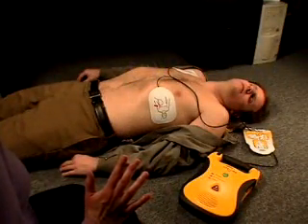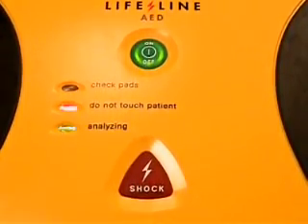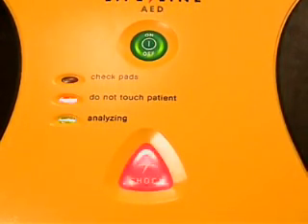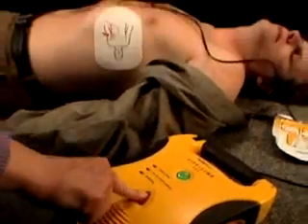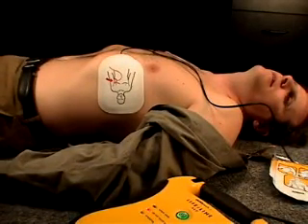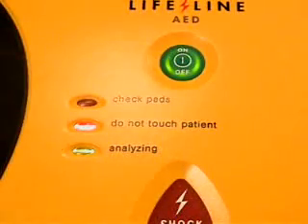Shock advised. Charging. Stand clear. If a shock is required, once the AED has fully charged, the shock button will flash and the AED will instruct you to press the shock button. Press the shock button to deliver a shock. Shock one delivered. Analyzing heart rhythm — do not touch the patient. Once a shock is delivered, the Lifeline AED will automatically reanalyze the victim's heart rhythm and repeat the charging process if another shock is required.